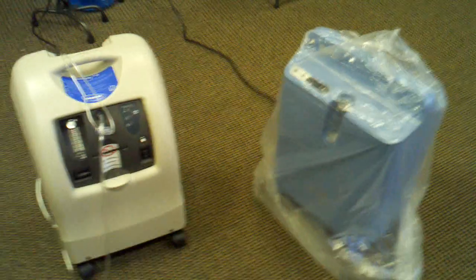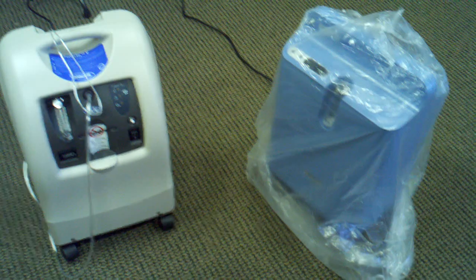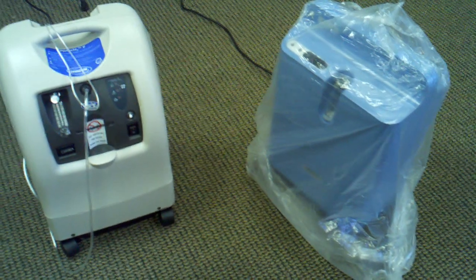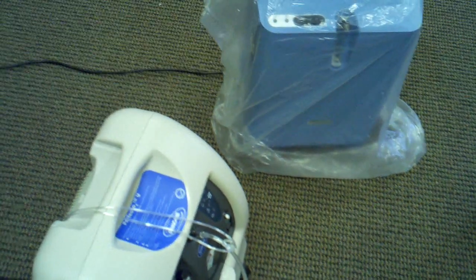Today we're going to be showing you the variations of the two welcome kits or the bundle kits we provide under the concentrator category on our website at GoSouthernMD.com. These are the two stationary concentrators that pretty much own a majority of the market in the country right now.